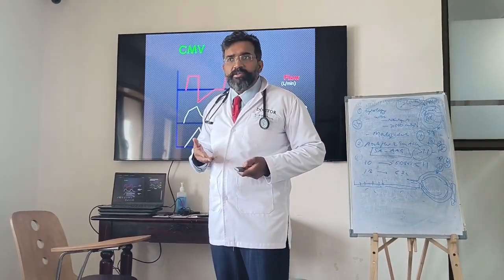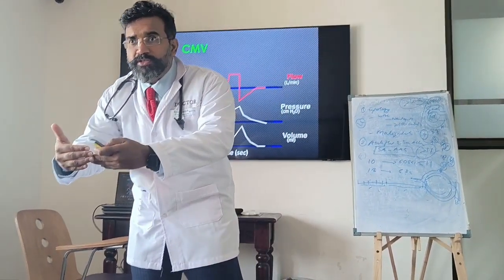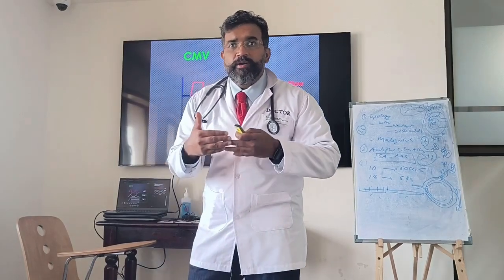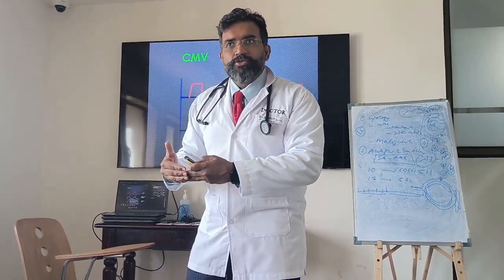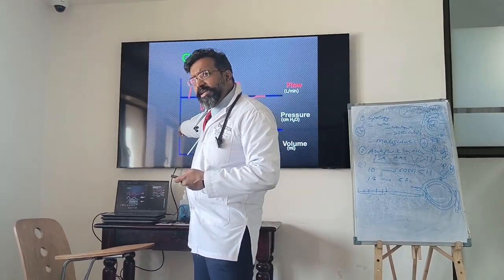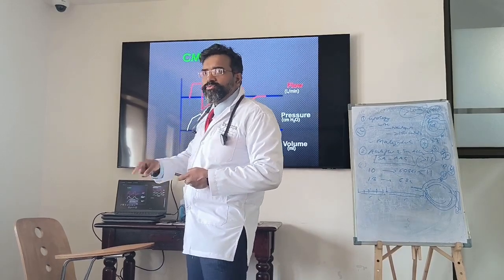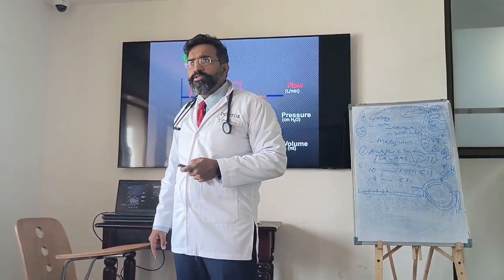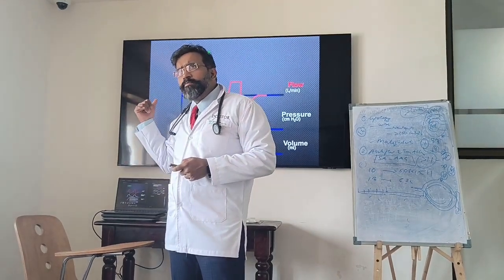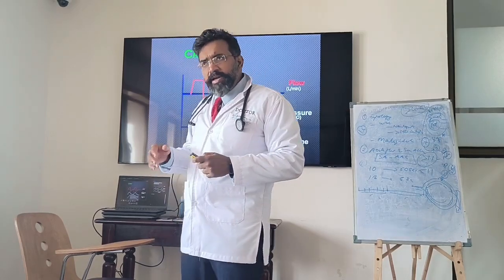So our patients are usually breathing, and what we want to do in ventilation, be as close as possible to the physiology. If I don't be as close as possible to the physiology, I am harming the patient. You understand? So is it good to have this kind of ventilator in the ICU? So can we have an anesthesia machine in the ICU? You got the point? Clear on this? So that is why nowadays we don't have this form of ventilation. It is replaced by another form.